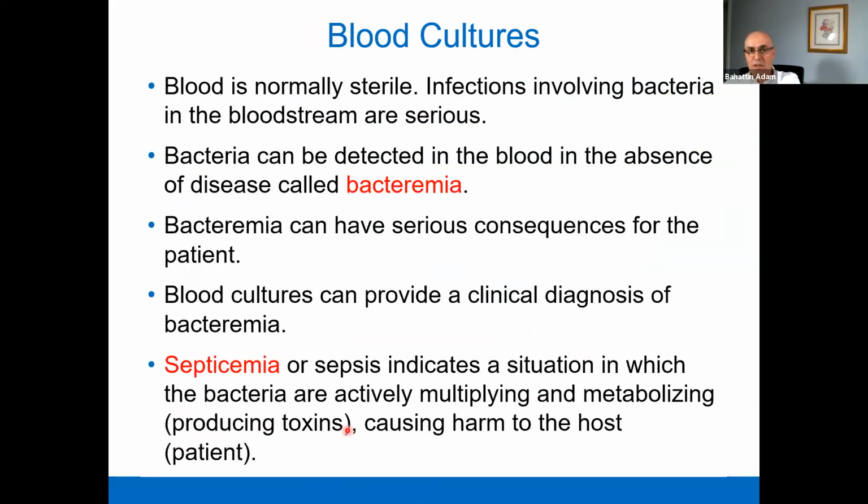Blood culture, maybe the most important type of culture in microbiology. We know normally the blood is sterile. A single microorganism in the blood is serious.